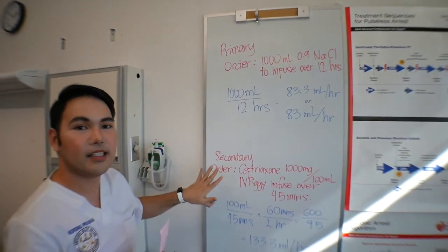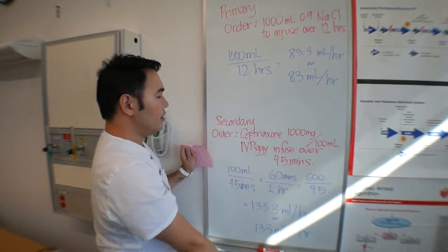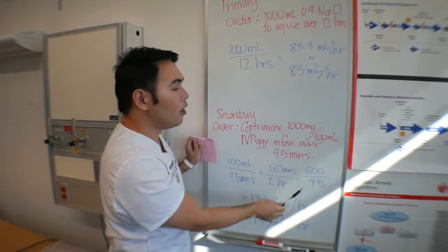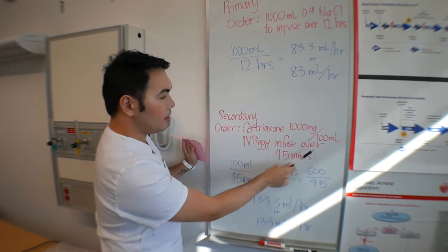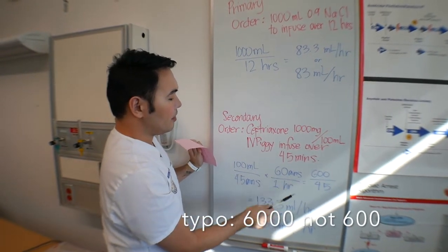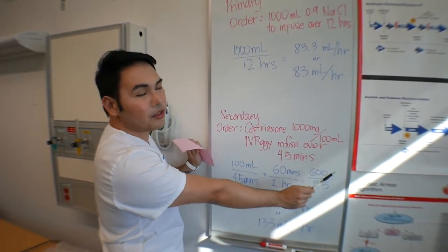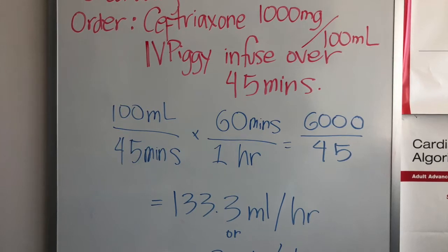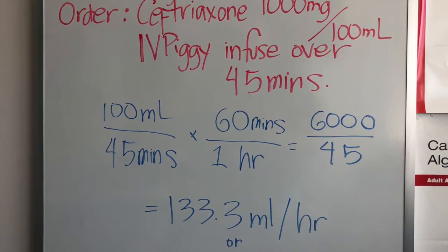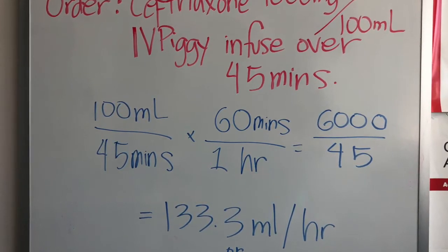This one's going to be your secondary. The order is 1,000 milligrams over 100 milliliters. The way I do it, I always start with what's needed. Since we need mL per hour, you always put the milliliters on top. So I put 100 over 45 minutes times 60 over an hour. This is how we do it: you multiply the top and you multiply the bottom, and whatever your product is, you just divide it, and then you will end up with this answer. So it's 133.3 ml per hour, and then round it off to the whole number. It's going to be 133 ml per hour. So these are going to be your infusion rates: 83 ml per hour for your primary, and 133 ml per hour for your secondary.